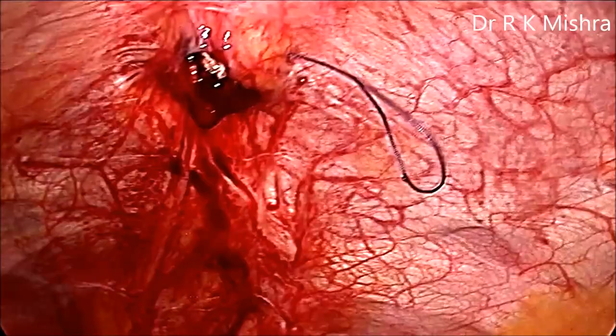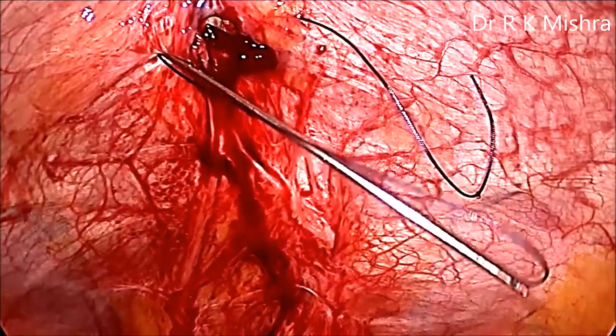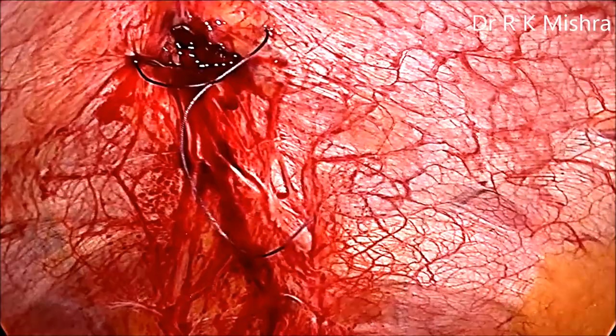You can pull the first loop out, and then from the other side of the wound, sparing the skin and taking the rest of the entire layer of the abdominal wall, you can reintroduce the Veress needle loop and entangle the suture which has been previously placed on the other side. That will encircle the entire abdominal wall including the peritoneum, muscle, and rectus, except the skin.